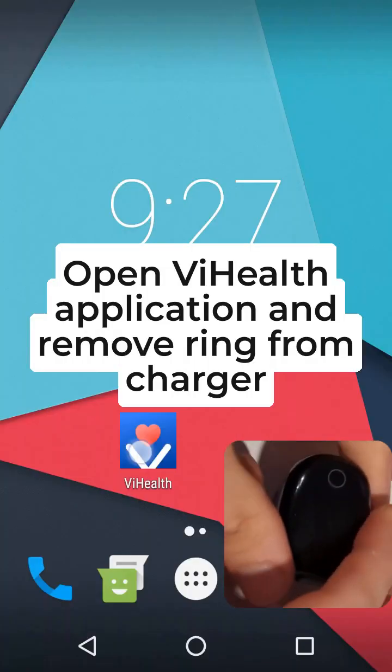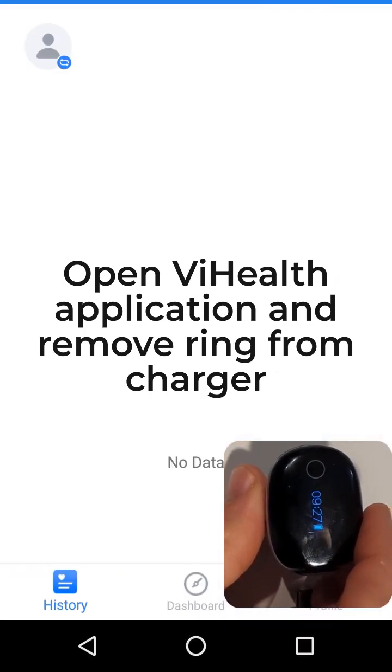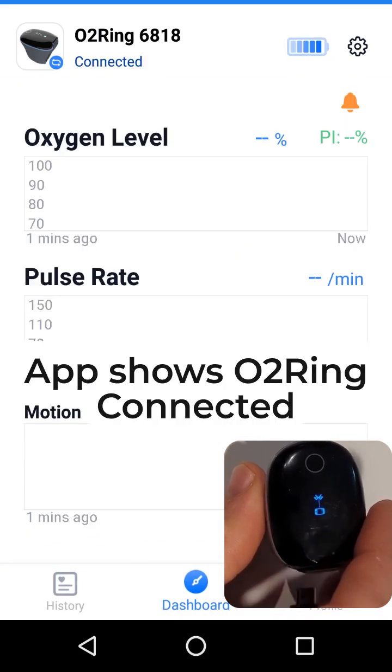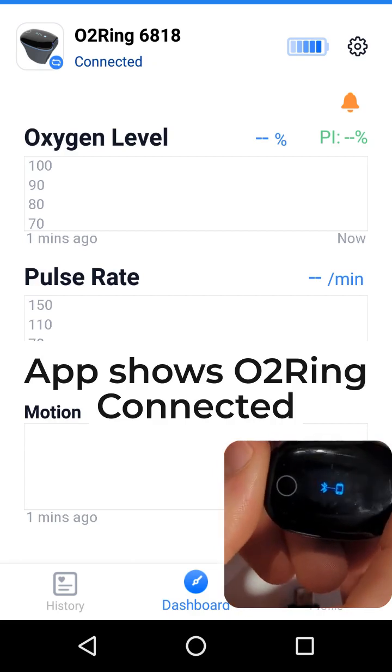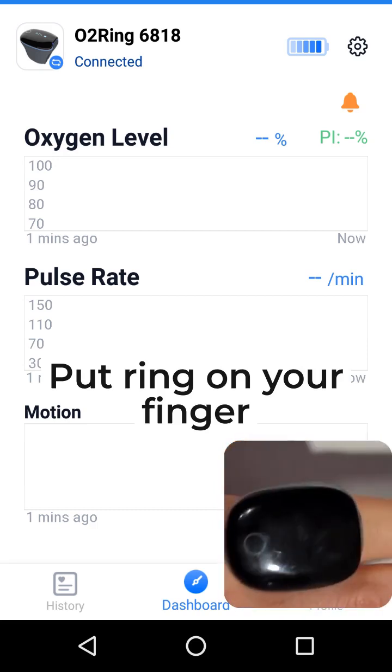Open the Vi Health application and remove the ring from the charger. The app shows the O2 ring connected. Put the ring on your finger.